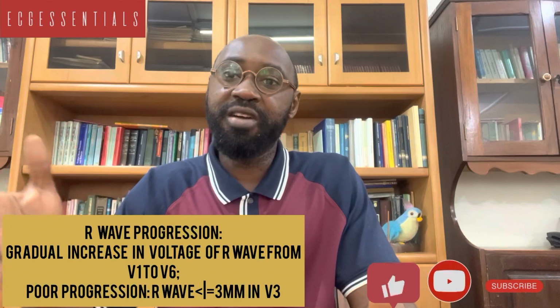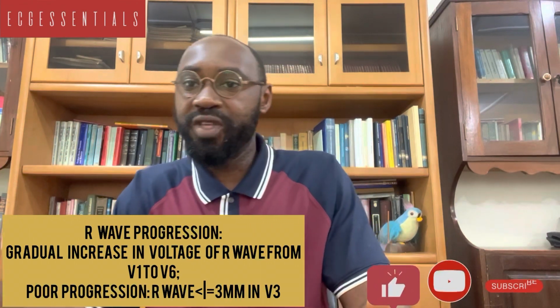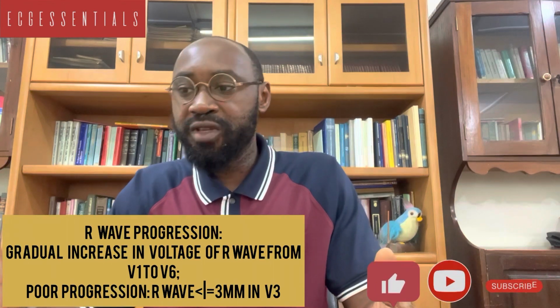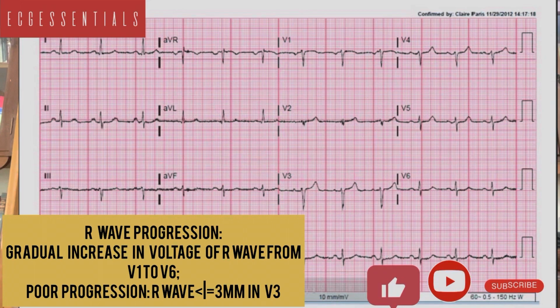The last bit about the QRS when we are interpreting our ECG is paying attention to the R wave progression. And that is simply the expected gradual increase in the R wave all the way from V1 to V6. And we say that there is a poor R wave progression when you look at V3 and the R wave in V3 is less than or equal to 3 millimeters.